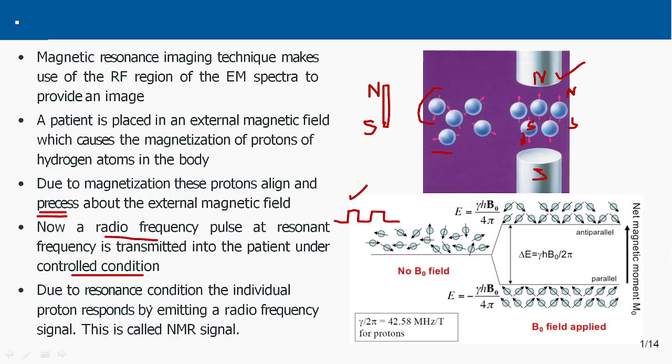Due to the resonance condition, the individual protons respond by emitting a radio frequency signal. This is called the nuclear magnetic resonance signal. So this signal has been captured.